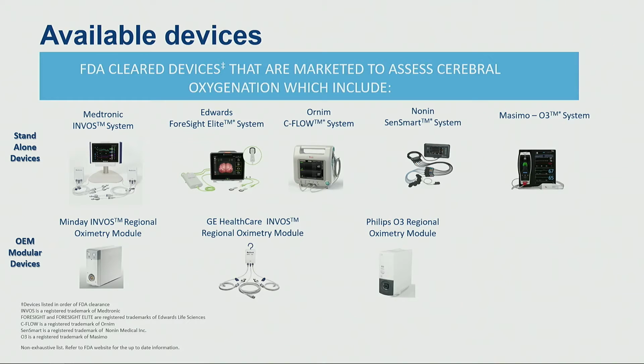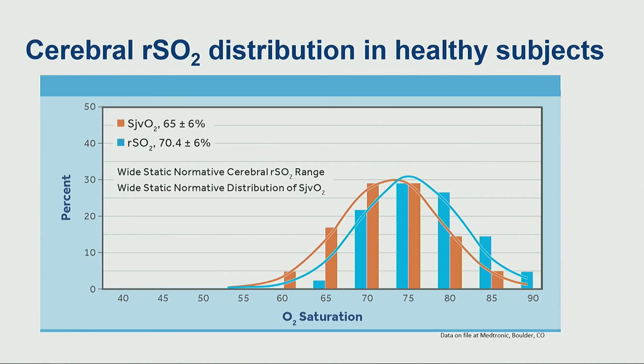In a world where we walk into a patient's ICU room and are distracted by the multiple things surrounding the patient, we often don't get to focus on the patient. I'd like all the data to come in a single visualizable manner. So anything that allows me a single focus, less monitors, and more data, I'd love to build my practice that way.